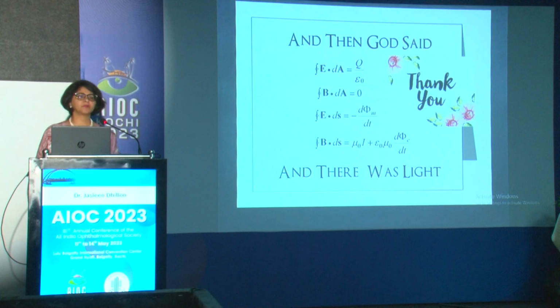Use particularly multiple readings, multiple formulae, optical biometers, and also check what the other eye is if it is pseudophakic.